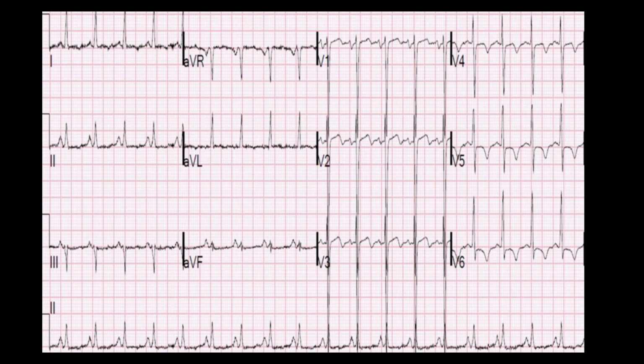Lead V1, we can also see with left atrial enlargement a biphasic P wave with terminal negative portion usually greater than a millimeter deep. And again, that's in lead V1, which you can see here. And biphasic meaning there's an upward and downward, or positive and negative deflection of that P wave.